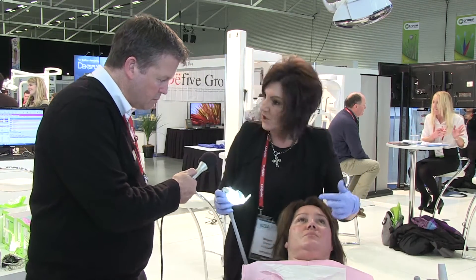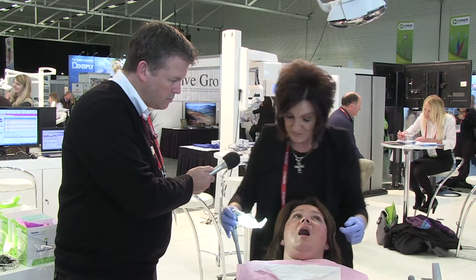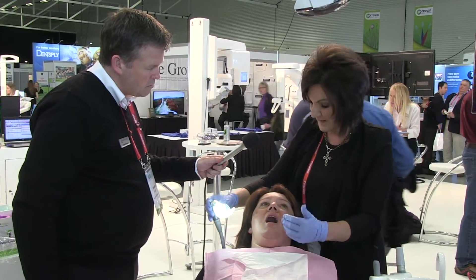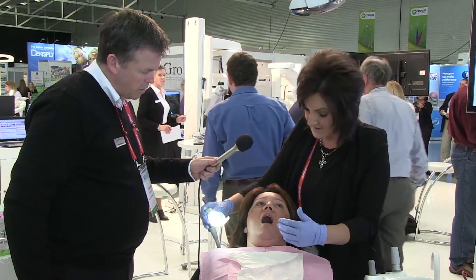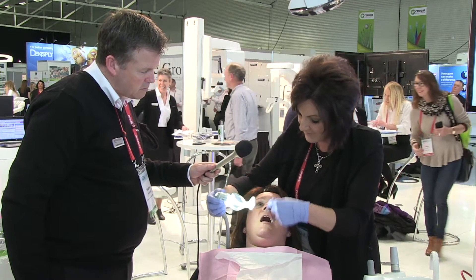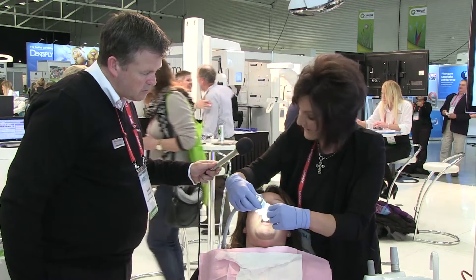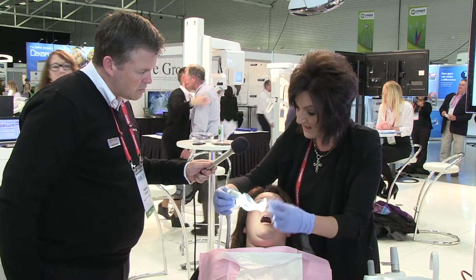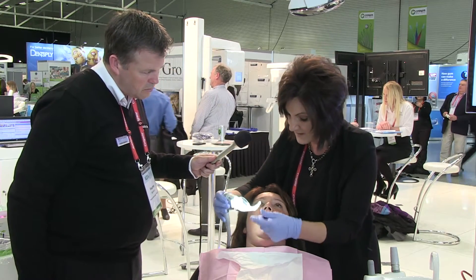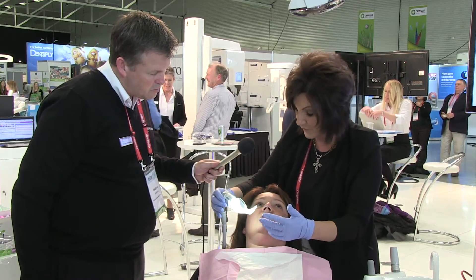I'll ask Kelly to open her mouth. The insertion technique is pretty important — it's unfortunately easy to gag a patient if the technique is not correct. A dentist is usually quite comfortable placing a bite block in the mouth, tending to come through the centre of the mouth, but a change of technique is really all that's required.